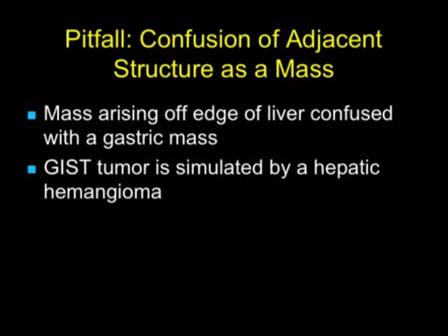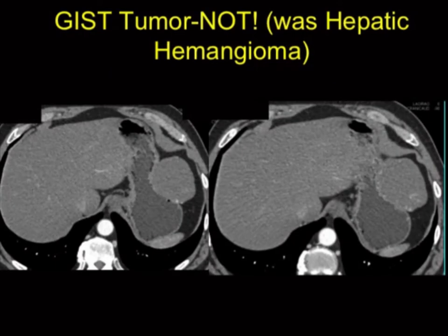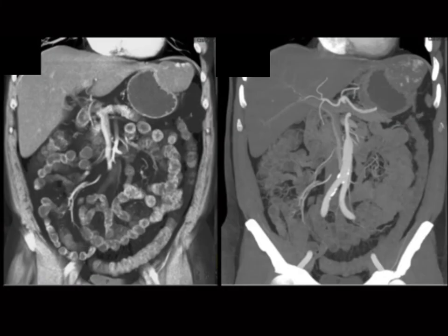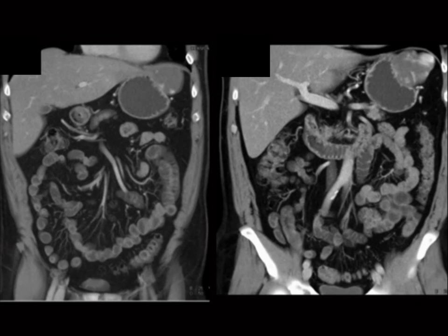Another pitfall: reading the report and assuming the history gives you the right answer, and when things are near other organs in a funny position you can be confused. A case was sent as a GIST tumor for preoperative planning — an exophytic gastric mass, classic GIST tumor, nothing to discuss. But as I was scanning, I noticed a little enhancement around the periphery. GIST tumors can enhance, but not around the periphery. And the lesion we thought was stomach actually touches the left lobe of the liver — it's pedunculated off the left lobe. We think of hemangiomas more commonly in the right lobe, intrahepatic, not exophytic — but sometimes tumors don't know what rules to follow.